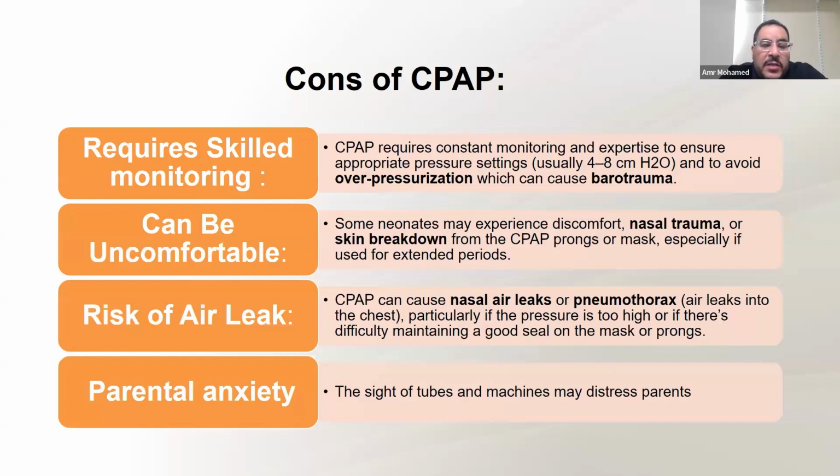And the cons of CPAP. It requires skilled monitoring, so it requires a skilled nurse and a skilled doctor to look after babies on CPAP. Make sure that the pressure is within normal range to avoid over-pressurization, which can cause barotrauma. It can be uncomfortable for babies, especially a big baby. We normally see them fighting with CPAP.